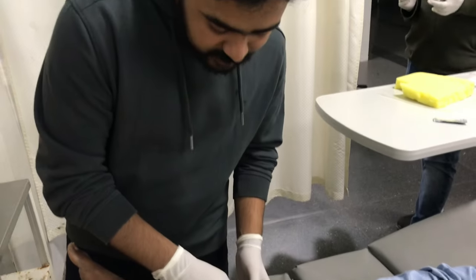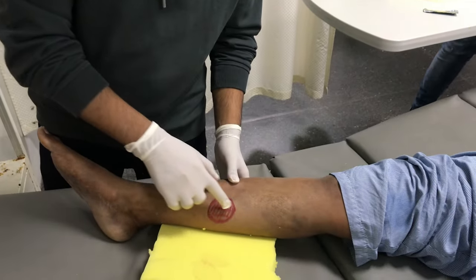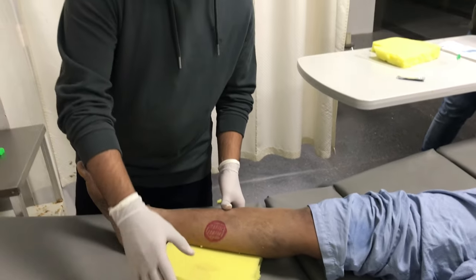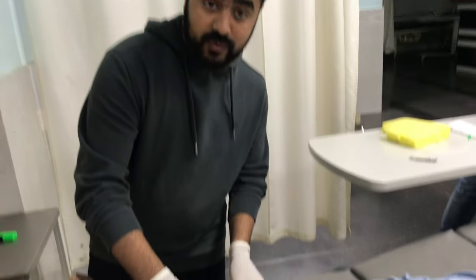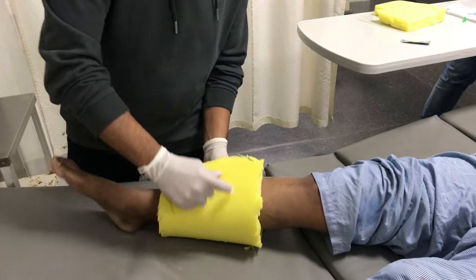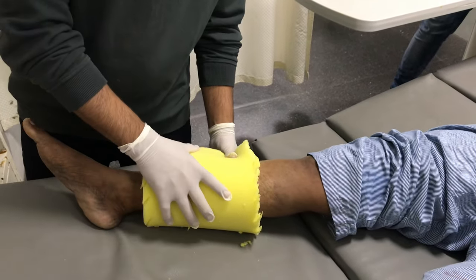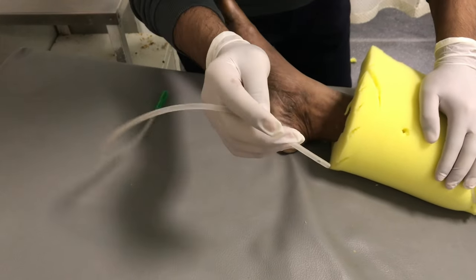For example, if this is the wound — around 2 by 2 centimeters — we have to cover the wound with this sponge. The sponge should cover the wound like this and should completely enroll it so that it is fully covered.